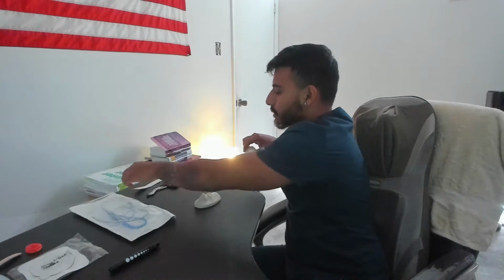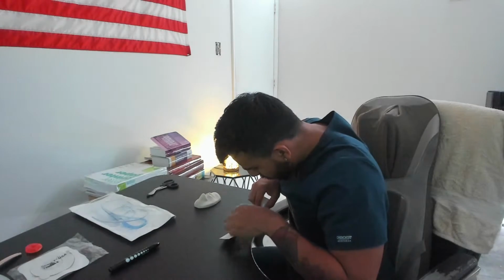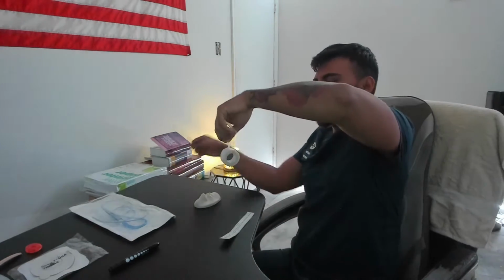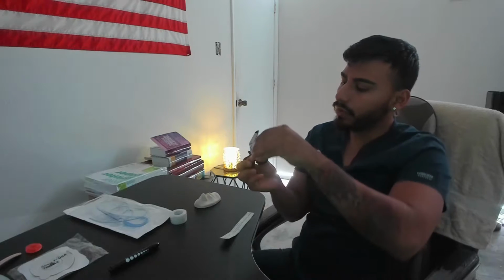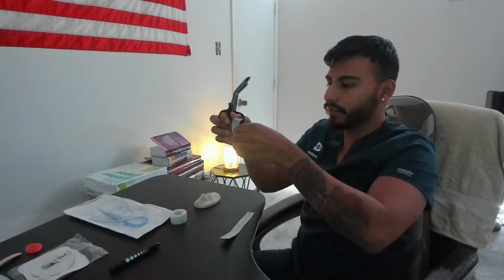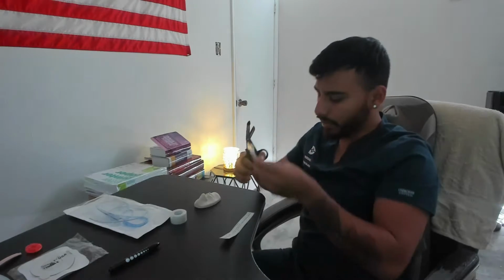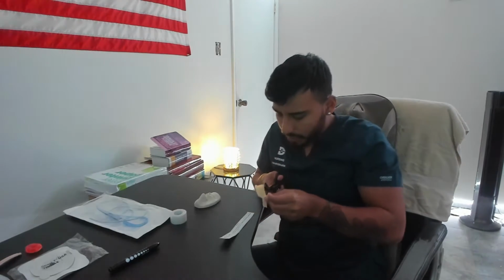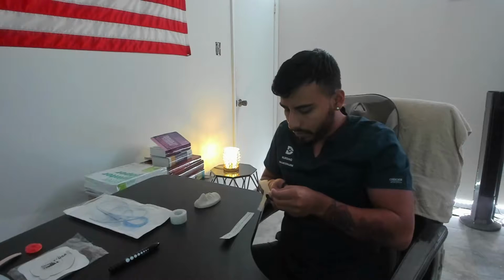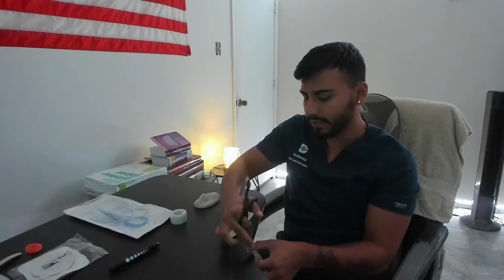Okay. So I'm going to use my tape. Okay, and I'm going to cut it. So I am going to cut 2 inches right down the middle, making pants. I'll verify with the ruler that it is indeed 2 inches, and the tape is 4 inches long.